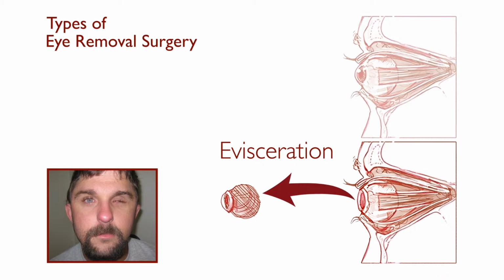The cornea and iris and entire retina and uveal tract are removed carefully, leaving behind the eyeball's white sclera and everything else inside the orbit. The eye muscles and the supportive web ligaments stay in place and are usually untouched. The only parts that are removed are the insides of the eye. The wet tissues in the front are still intact, and the tear system is unaffected. The eyelids are only spread to perform the surgery.